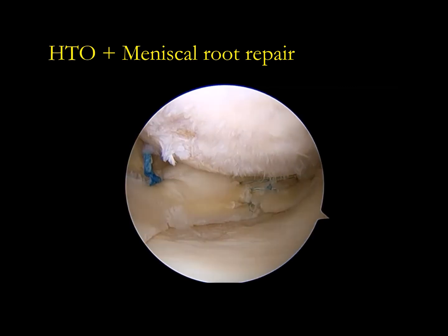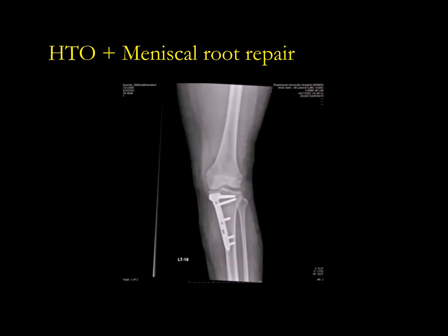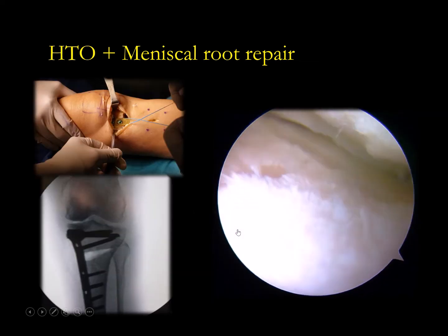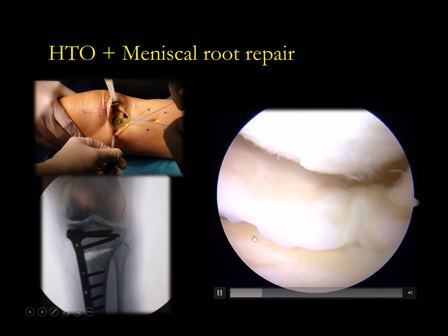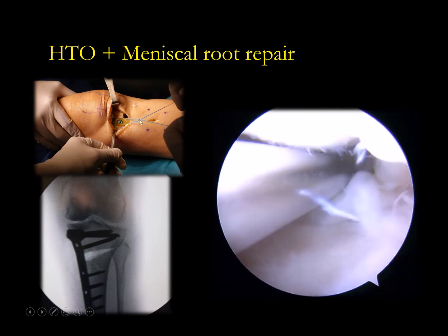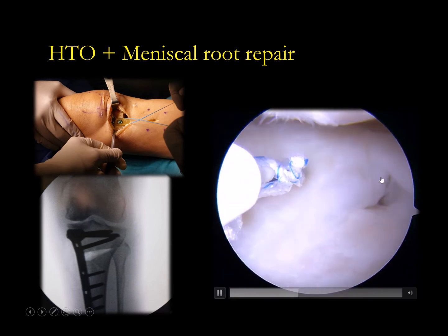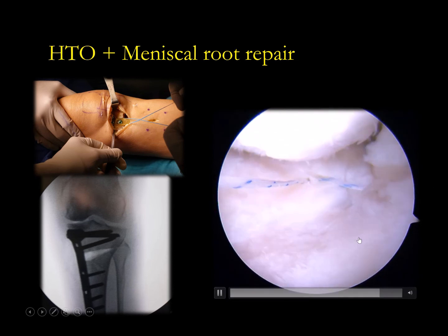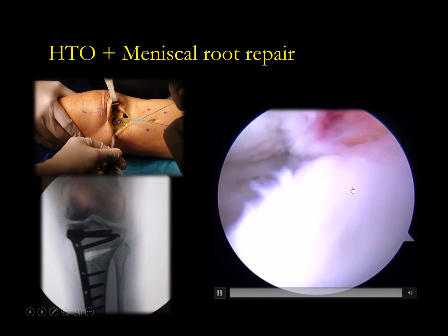Because if you make a transtibial tunnel, the problem is the tunnel of the screw will merge into your tunnel. Screw jam to tunnel. Another way is you can do this way, this osteotomy. You see the cartilage is gone. Okay, you can make a transtibial, but be careful, the screw can injure your suture. Okay, so we make all inside repair using the fast fix with this way.